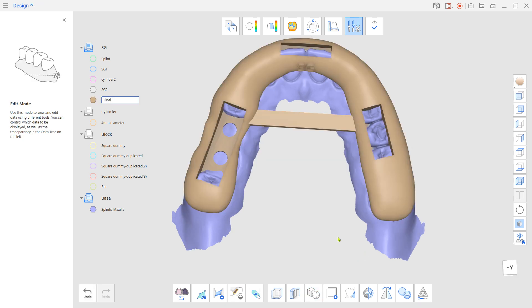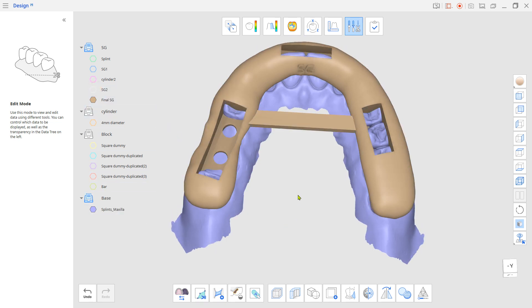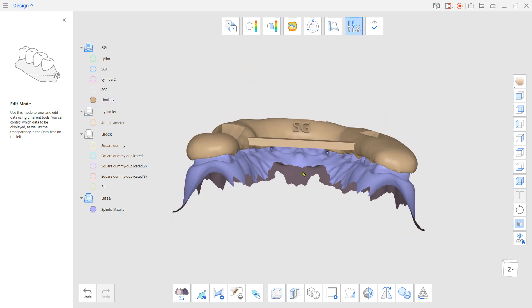Now you have the non-sleeve type simple surgical guide to print out on your 3D printer.